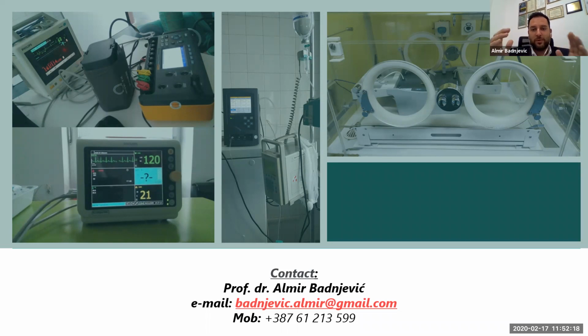From another point of view, if you want to calibrate your defibrillator tester from 0 up to 360 joules, you must ask at which points they can calibrate it. Can they calibrate at each point, at 0, 10, 20? If they can, it must be proved in their calibration certificate, so it is publicly available. You must also check whether they are able to cover the whole range, because maybe they can cover just from 10 up to 200. Then your device will not have a calibration certificate for 0 to 360. They can perform it, but you must check whether they are accredited for those points too. So take care: is their equipment more accurate than the testing equipment you are sending to calibration? Can they cover all the points and the whole range that you need?